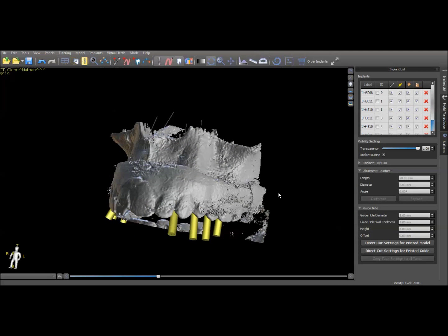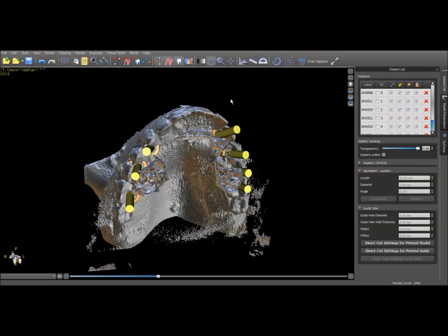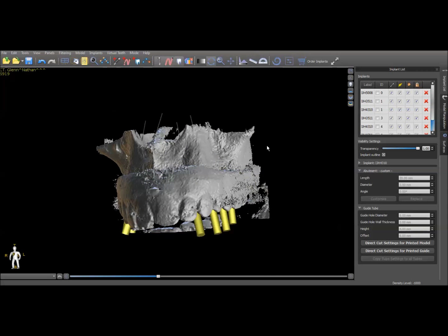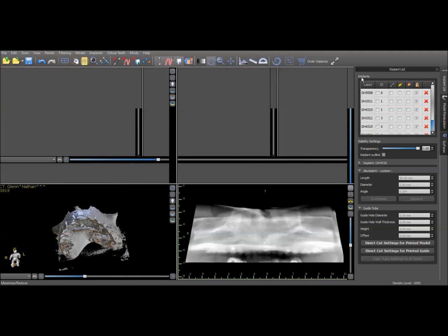Now that we've got our implant positions planned, the only thing we need to accomplish is to be able to make a guide. You wouldn't expect to be able to make a guide on this surface — it's got far too much scatter and distortion — so what we need is a way to import the tissue surface model so that we can generate a guide that will put the implants in the proper position. We'll turn these off and I'll show you how we can accomplish that.